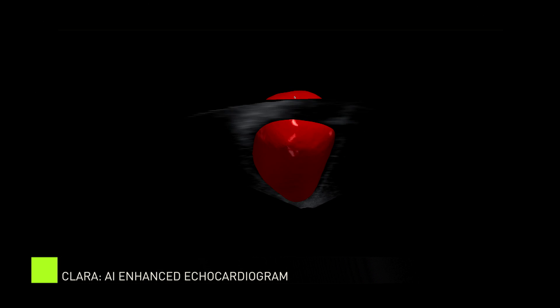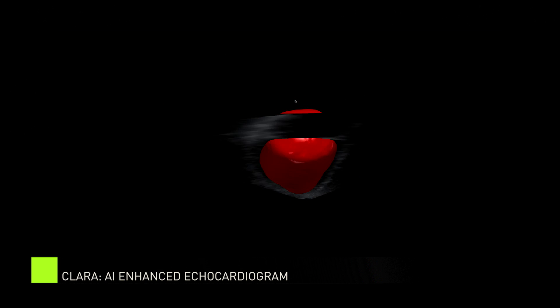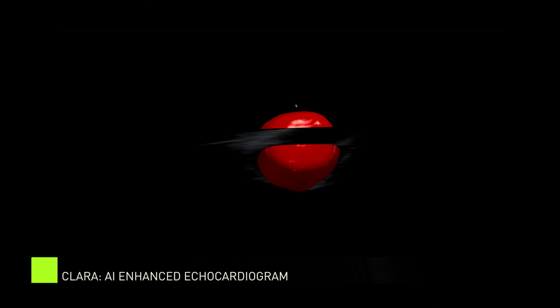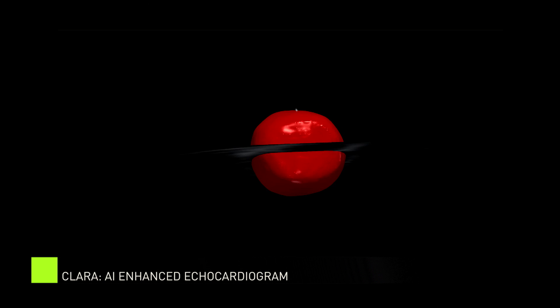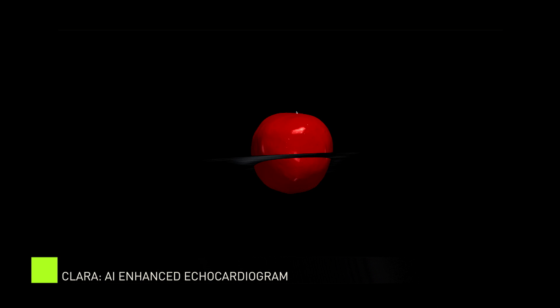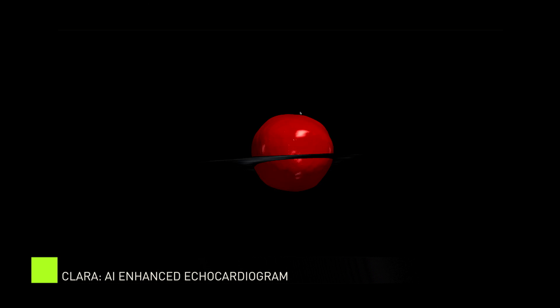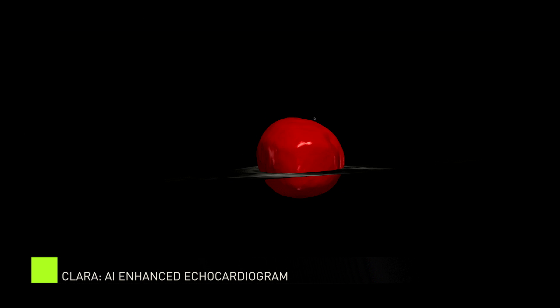This volume was created using a convolutional neural network AI that learned to predict the endocardial border of the left ventricle frame by frame from voxels to simulate a 3D beating heart. Then it automatically calculates the ejection fraction of the heart.